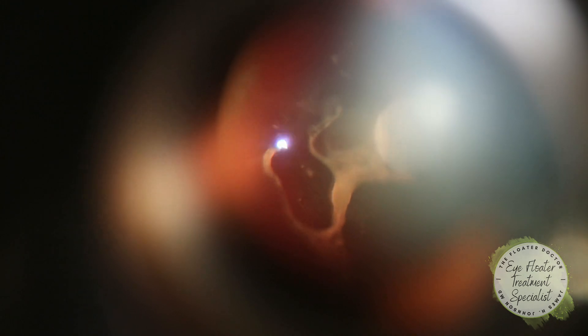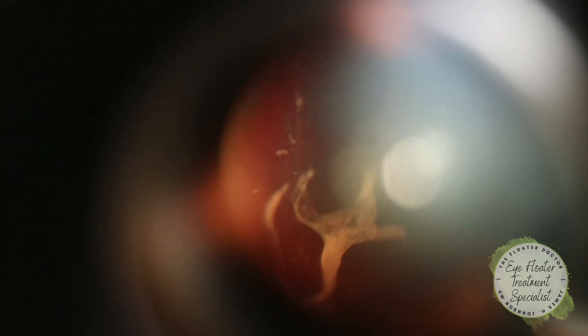The floater is in the front half of the eye, which makes the optics even better and more visible. I'll split the Weiss ring right there and then chase after the end piece. With each hit you can see microscopic bubbles — maybe 20, 30, 40 bubbles — that mostly dissolve within minutes. I'll chase down some little fragments here.